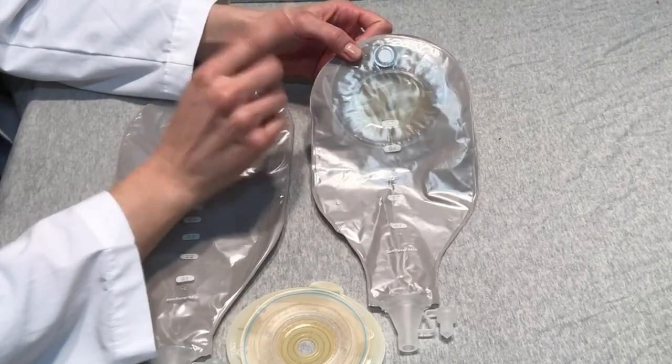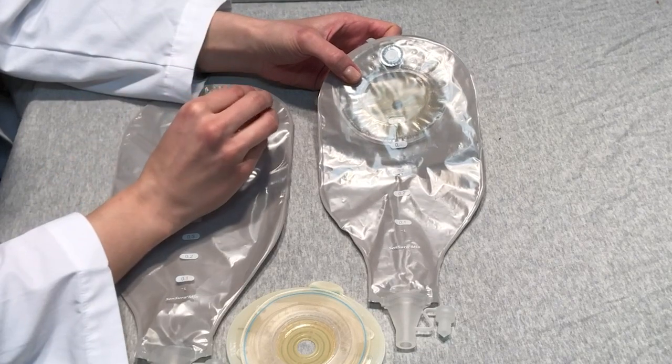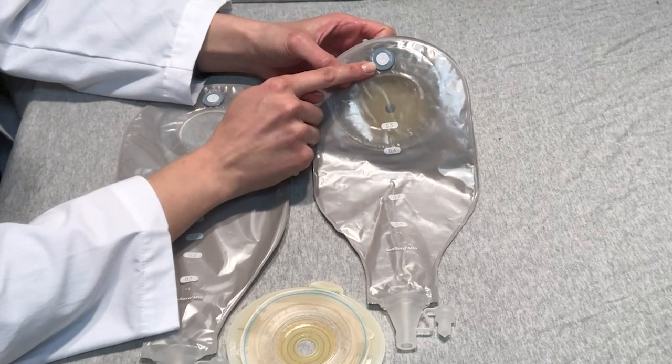This is our pre-filter. This helps catch any thicker particles in the stool, in the high output ileostomy stool. That will help prevent our charcoal filter from getting clogged up quickly.